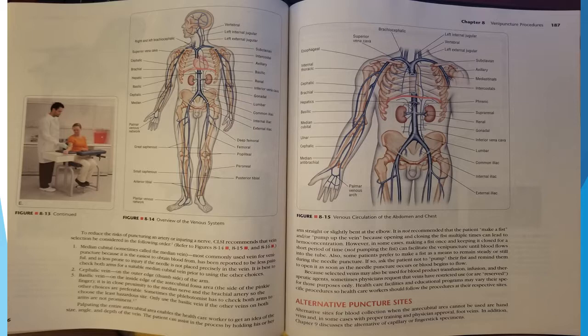Number 1, median cubital, sometimes called the median vein. It is the most commonly used vein for venipuncture because it is the easiest to obtain blood from, and has been reported to be less painful and less prone to injury if the needle is not placed precisely in the vein. It is best to check both arms for a suitable median cubital vein prior to using other choices.